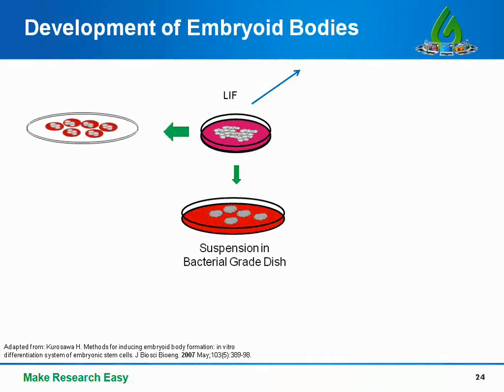Now basically, this strategy is to take droplets from your original culture of differentiating embryonic cells and place them on the top of a lid in a culture dish. Now the drops should be uniform in size, and this will ensure that each embryoid body will have the same amount of embryonic stem cells.